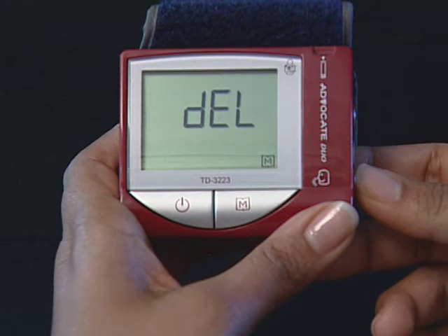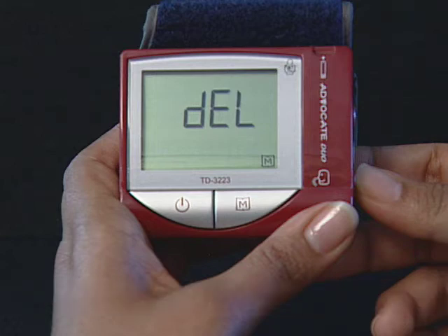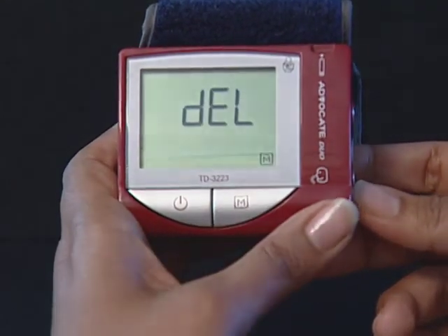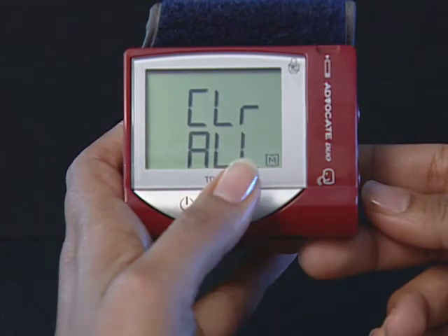Step 8: When DEL and a blinking M symbol is displayed, if you do not want to delete the memory, press the set button again to skip this step. If you would like to delete all memory, press the M button. Both DEL and the M symbol will flash. Press the M button again to delete all memory. Clear all appears and then the monitor automatically goes to the next step and the speaking volume number flashes.